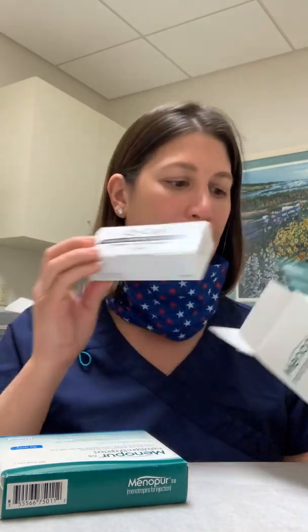These are the Q-caps. These are an apparatus that is used to help mix the medication. In this actual Menopur box, there will be 10 vials. Five will be the actual medicine and five will be fluid — sodium chloride, saline, whatever you want to call it.